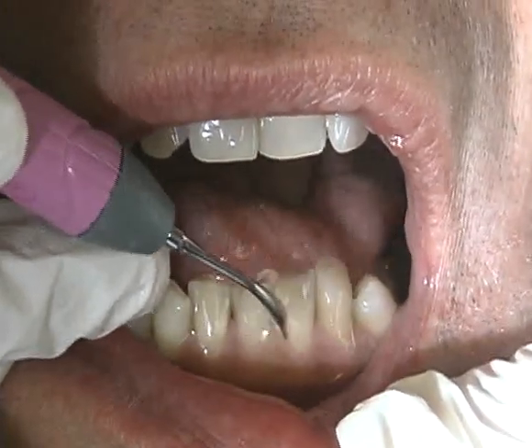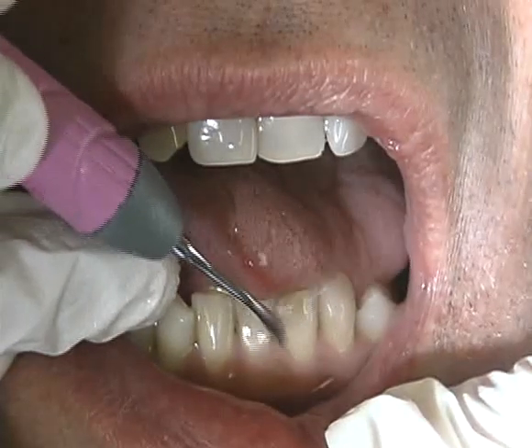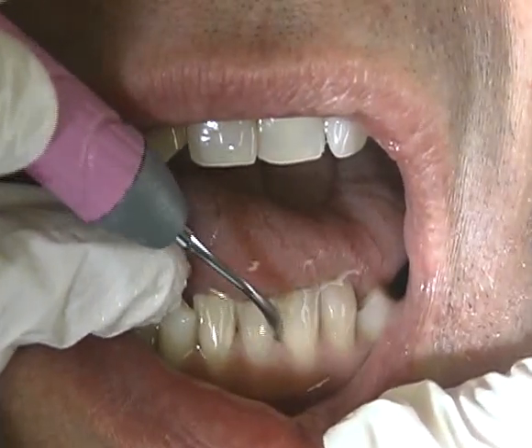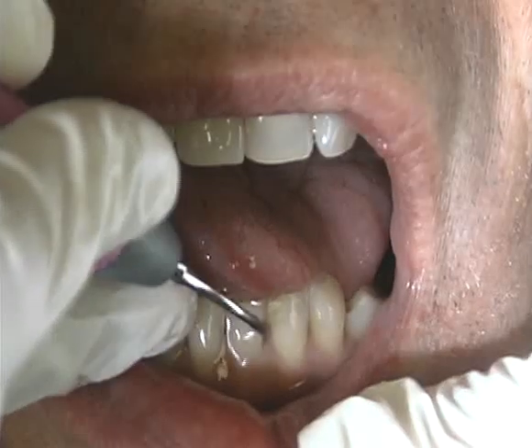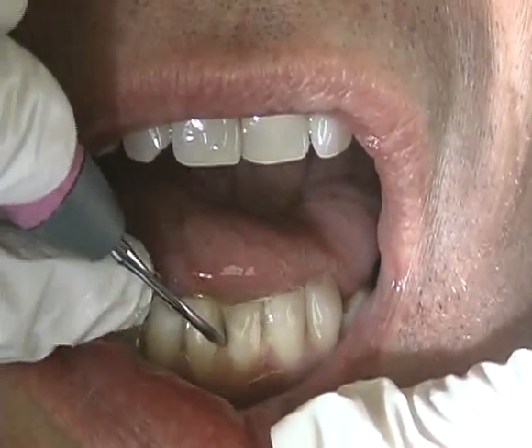The standard diameter design of the No. 10 Universal efficiently removes moderate to heavy deposits. Its straight shank can be used on all accessible tooth surfaces. These designs are most effective on the buccal and lingual surfaces of all teeth and the interproximal surfaces of anterior teeth.